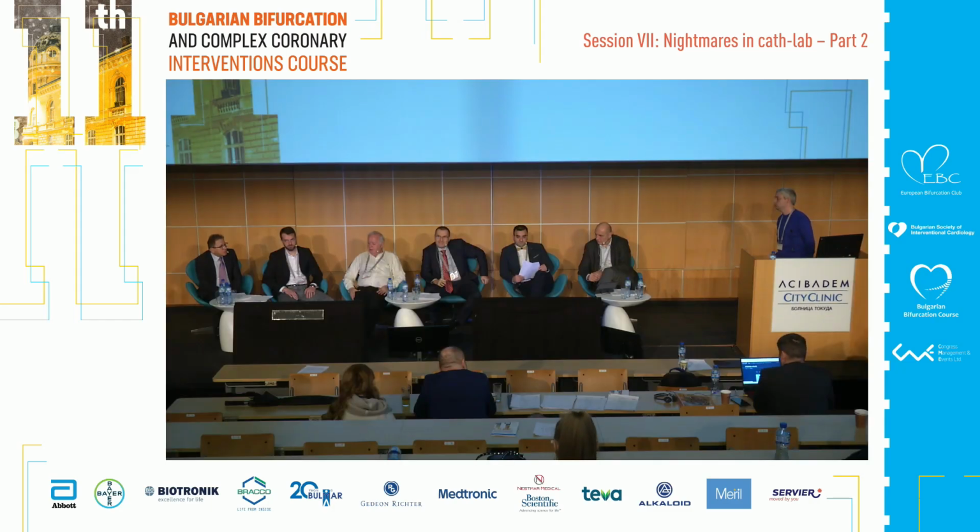You know, you never know how your predilatation will change the nature of the calcium. These nodules, much bigger than in coronaries, are able to make really very unexpected situations. We have to be very cautious. It's better to check with ultrasonography also the preparation of the valve, not just make predilatation and forget.